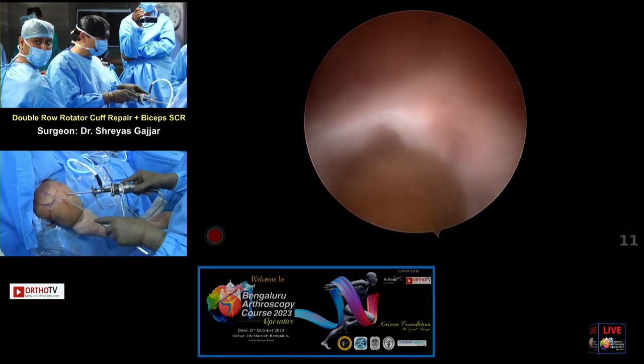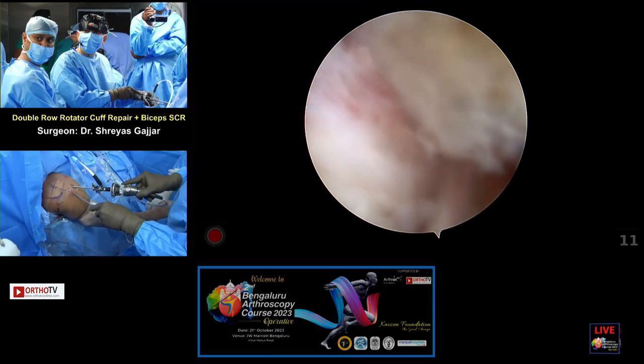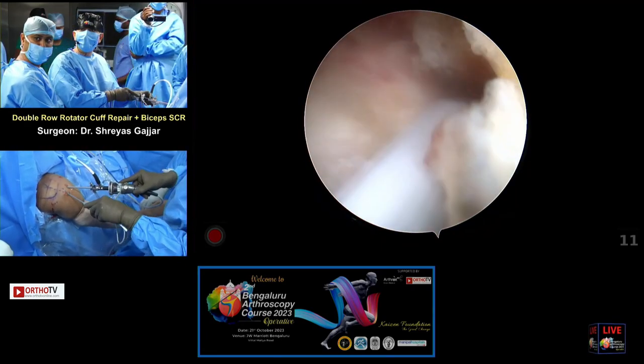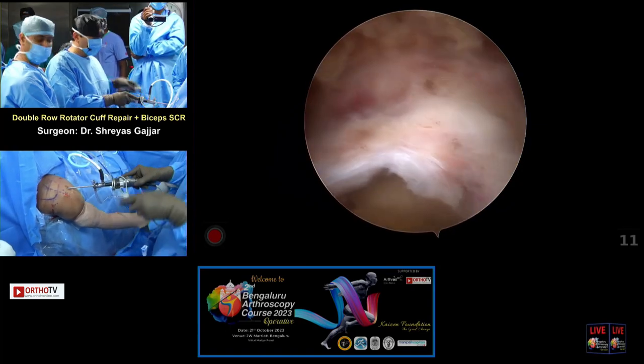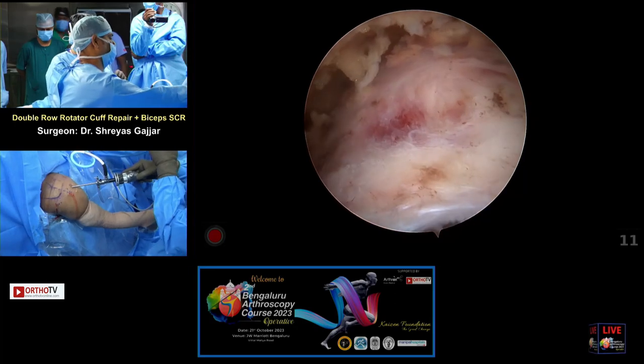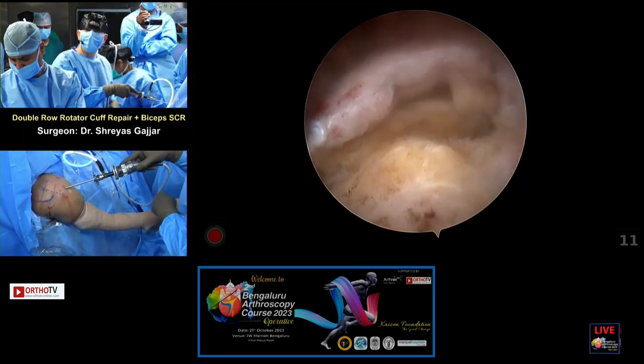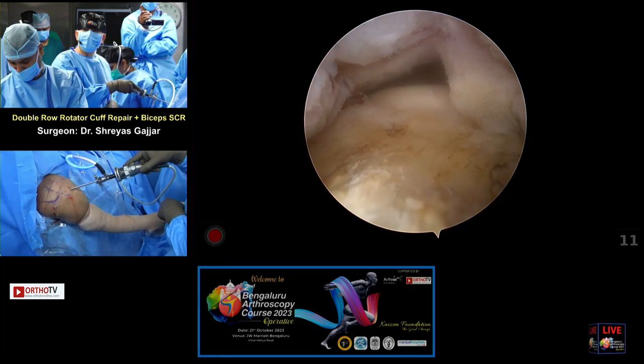There's some bleeding. I'll just try and control. Okay, so we are ready for the burr, please. Can I just have the burr? I'm just going to prepare the tuberosity laterally a little bit. I've already prepared medially, as you can see.